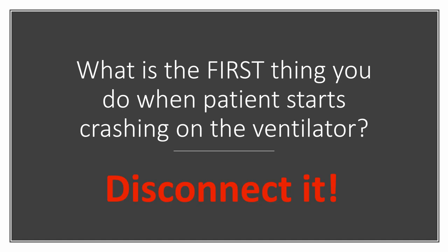Also, when you put them on a BVM and you squeeze that bag, you actually can feel the resistance and you know what's happening. But you also have to be aware that if you've had them on high levels of PEEP before or when they were on the ventilator, and if they required those high levels to actually oxygenate, then you're going to have to use PEEP, because PEEP recruits alveoli. And if it took a while for all of those alveoli to get recruited with that PEEP, once you disconnect them, you're going to lose that recruitment. Those alveoli can collapse again.